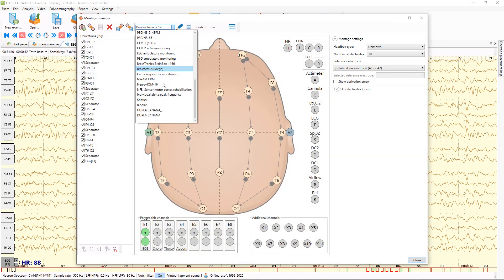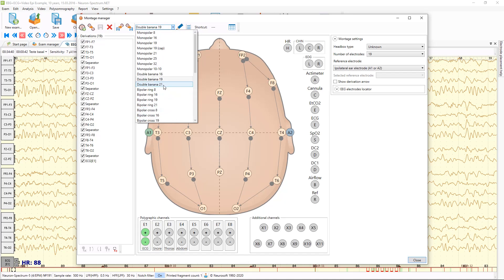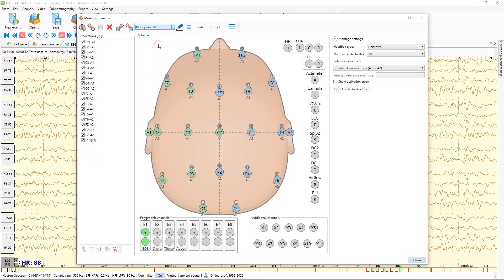Here you can see the available list of montages. You can change the current montage, and here you can also create a new montage.